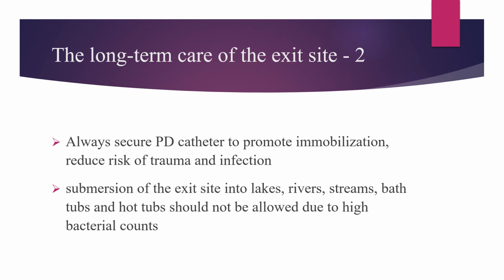You should always secure the catheter to promote immobilization and reduce the risk of trauma and infection. Avoid submersion of the exit site in lakes, rivers, streams, bathtubs, and hot tubs due to high bacterial counts.